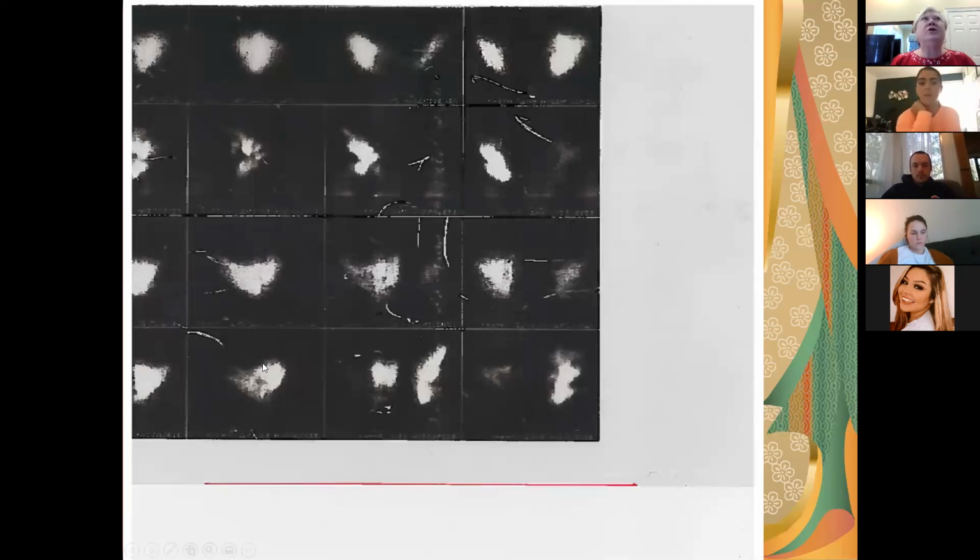These here are not it. These here are laterals where they only see one lung because they're only looking from the side. Okay, so it's not these. That's why I have it off to the side. It's these. So this should show two equal lungs. It should show blood flow that's equal. And as you can see, they are not equal. All right.